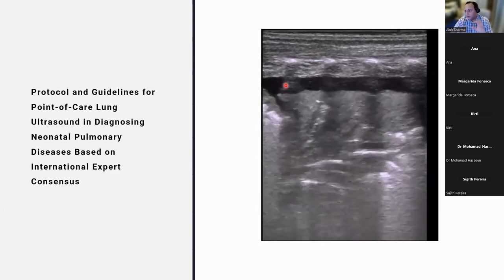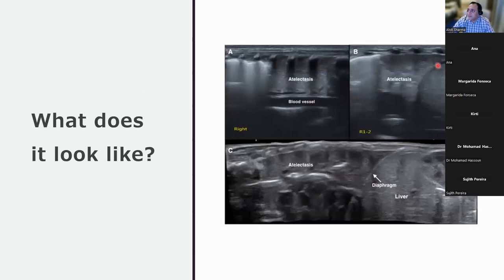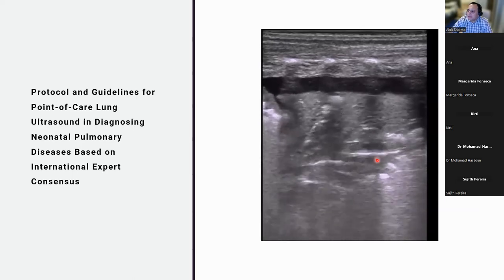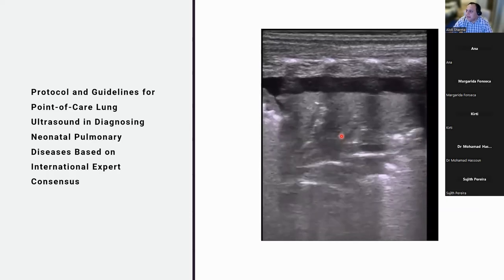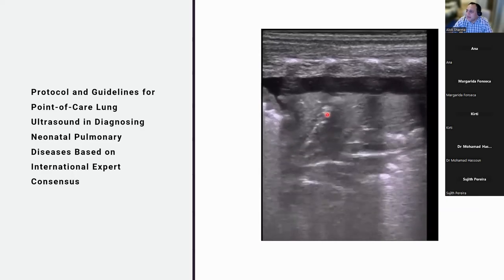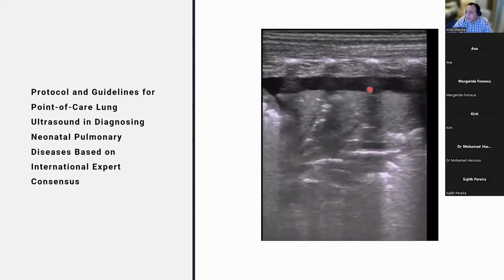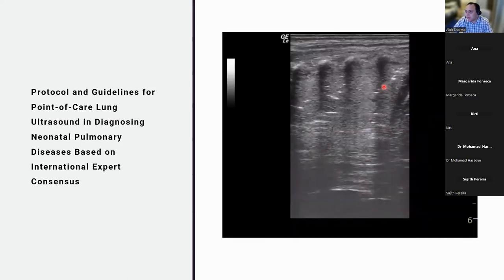And this is why I wanted to go through this with you. This is really, really important: can you see the difference between a compressive atelectasis versus an atelectasis that might be a focal area because of lack of tissue aeration? Again, much better visualized over here, very well demarcated. This probably is because of lack of aeration. But here what you've got is compressive atelectasis. They can also have areas of static parallel air bronchograms. It's a very large area of collapsed atelectasis. But then you have dynamic air bronchograms where the air is actually able to enter the lung. So this does not necessarily mean this is a pneumonic consolidation. This might just be compressive atelectasis secondary to a pleural effusion, maybe a chylothorax, depending on the history. And that is why clinical correlation is so key.